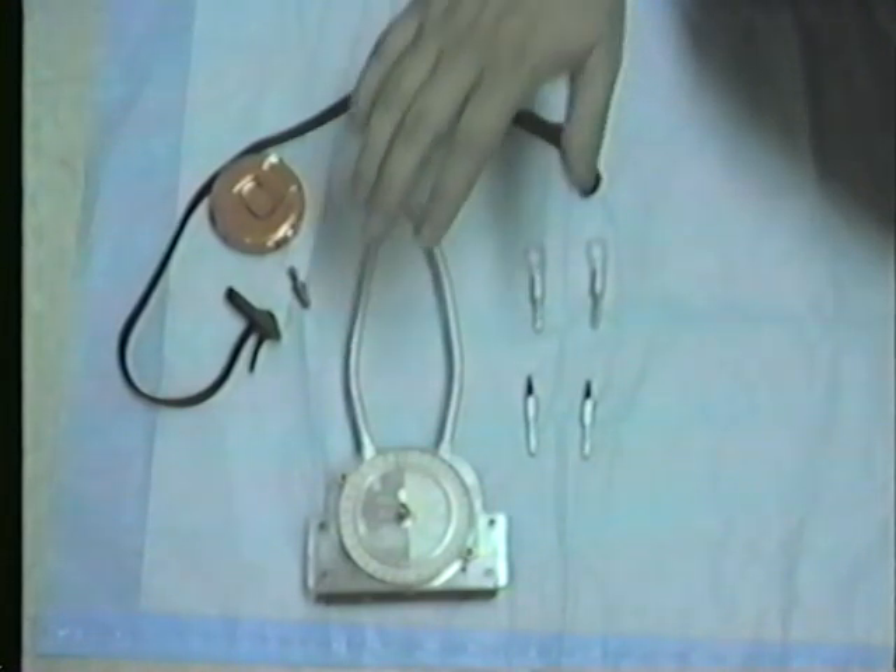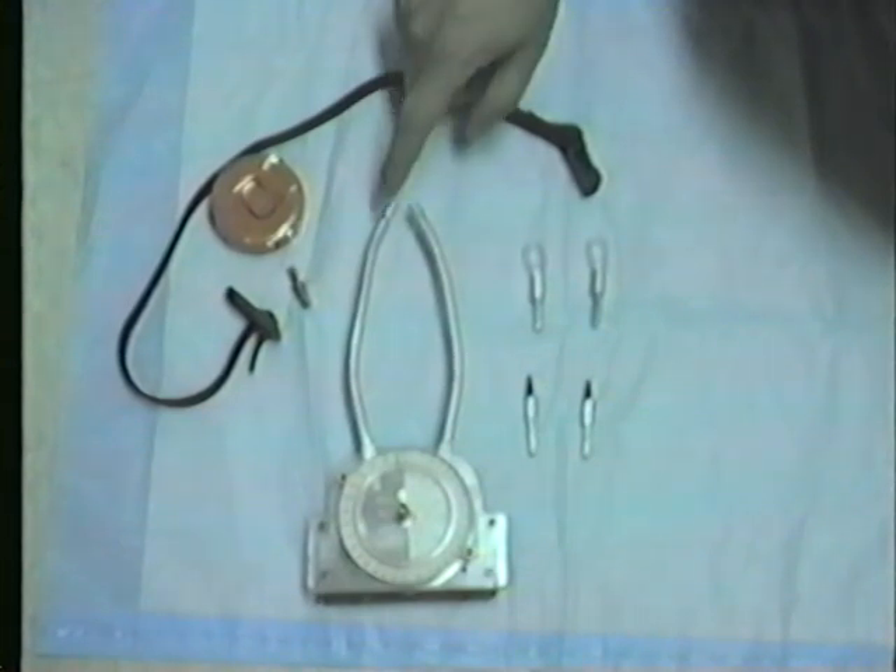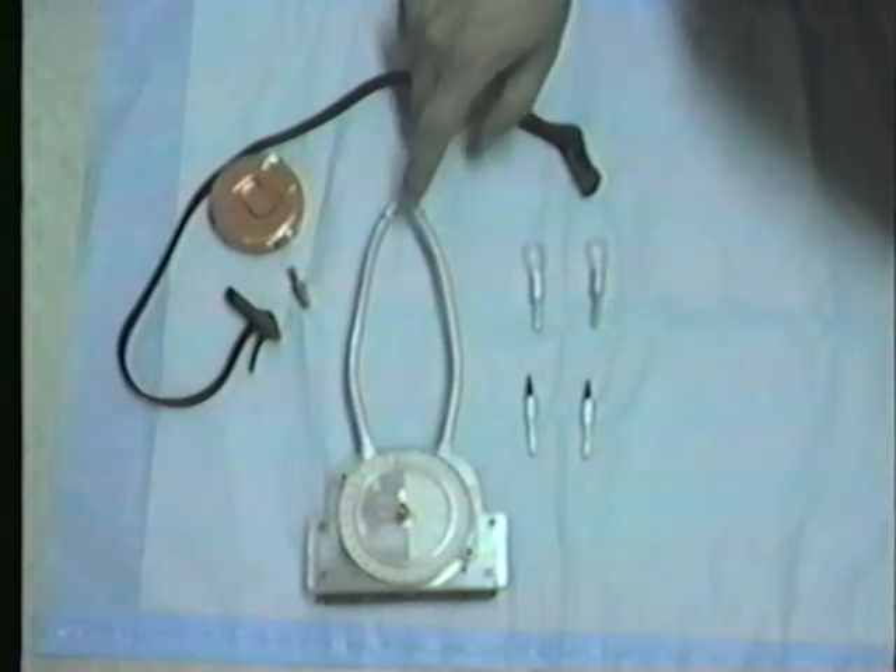The tool is basically a combination of a dial caliper and an inclinometer. It will measure the distance and inclination between two landmarks that are contacted with the ends of the measuring arms right here.